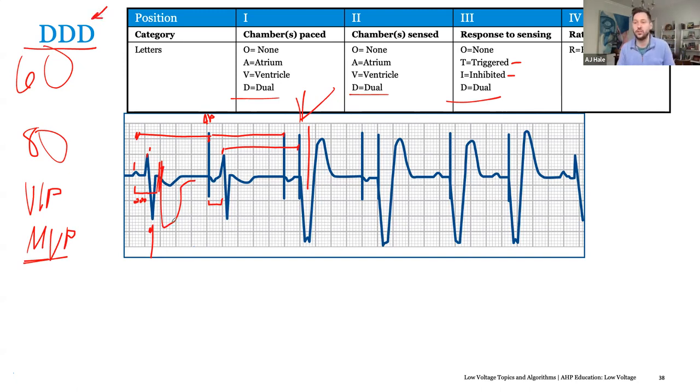But as you said, you have these patients with complete heart block. They're not going to be conducting much. So we are going to be tracking the atrium, but we'll probably keep our AV delays short if we know they're not going to be conducting. I'll keep it at 200 milliseconds. I'll keep it at 180 milliseconds. And then I'm just going to pace no matter what, because we know there's nothing intrinsic going to break across, but we still want to maintain that atrial synchrony and also regulate the heart rate based upon demand. If the patient's exercising, their heart rate's going to go up, and we want the device to follow that. We don't want to pace them at 60 beats a minute all the time. Does that make sense?